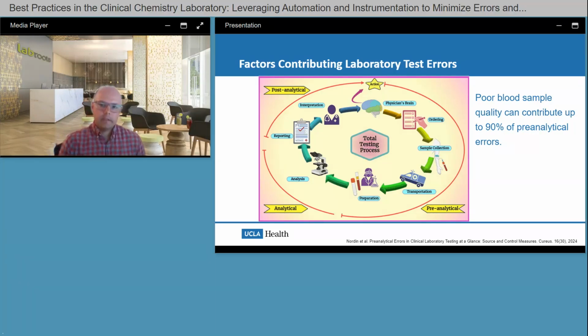Not too long ago, we had a case in the hospital of a newborn suspected of drug exposure from the mother, and the immunoassay screen was negative, but it only has a limited panel that it looks for. So they wanted to send it out for a broad screen by mass spec. And this is because this test is not embedded in the ordering menu. You have to request it under a different procedure as miscellaneous. So it's a little bit more lengthy, and there was a lot of delay. There were a lot of errors. The wrong specimen was ordered. The wrong test was ordered. So we had to go back and forth, and a few days passed by until we got this all sorted out.